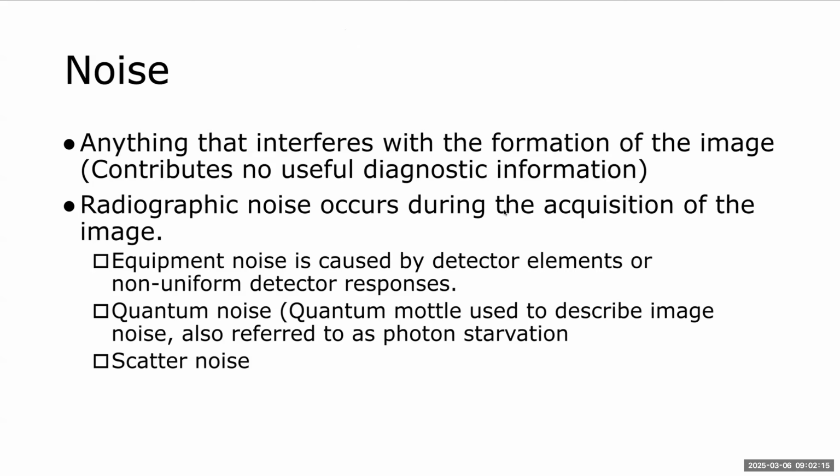So ambient noise is created from general background noise. So with CR, that could be a real problem. If you had CR cassettes just sitting around all weekend, maybe your facility isn't open on the weekend, so those aren't being used.